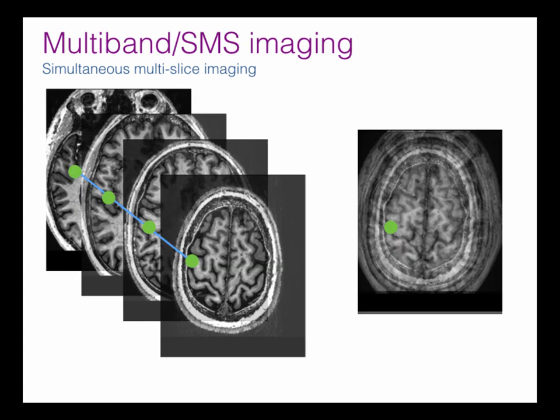So what's the problem then? The problem is that we have all these slices excited simultaneously, but when we read out along the x and y directions, the readout and phase encode directions, all the slices get collapsed together directly. When we read out our image, we end up with a superposition of all the images. Basically, it's a projection taken along this line, and you get the sum of all these 4 positions together.